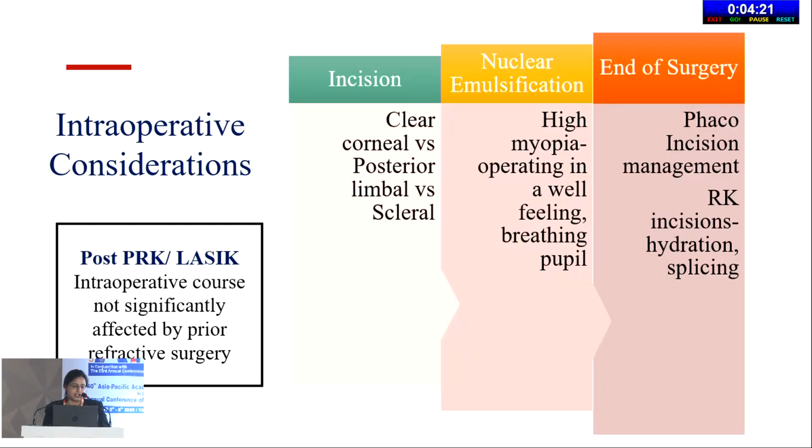Intraoperative considerations. Post PRK and LASIK, the intraoperative course is not significantly affected by the prior refractive surgery. For post-RK, the incisions, nuclear emulsification, high myopia, and operating in a well-filling and breathing pupil may pose a problem. And at the end of surgery, in incision management, splicing may occur.